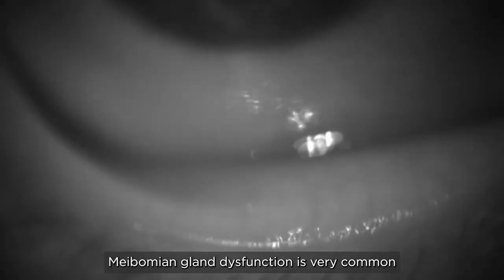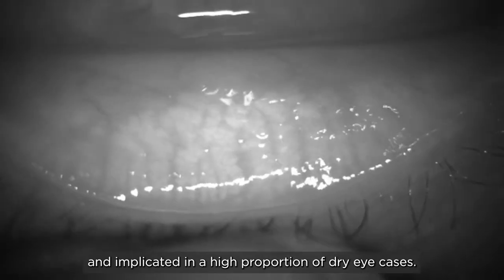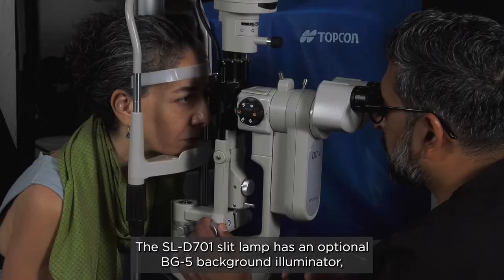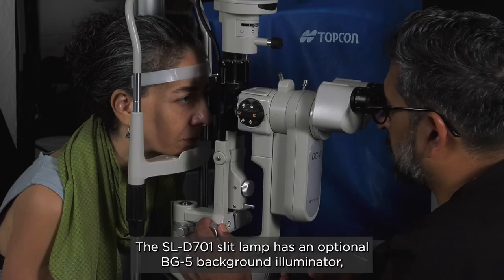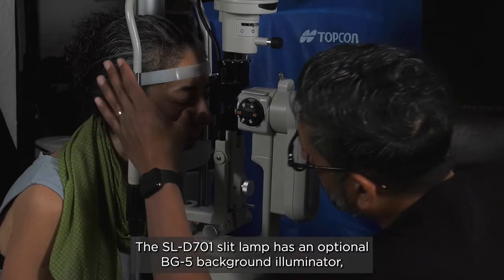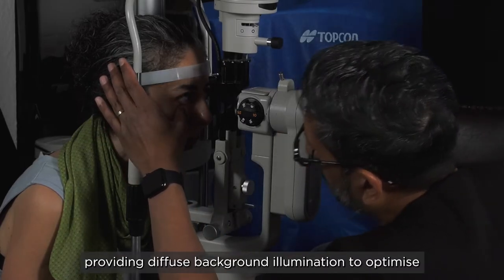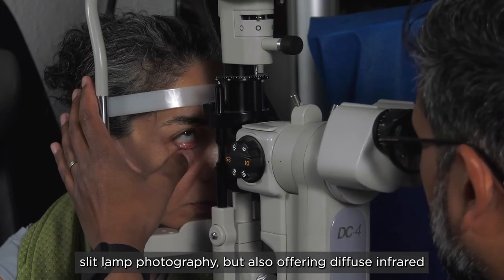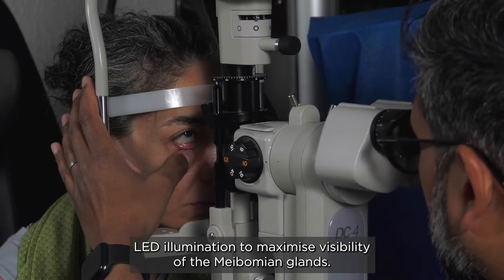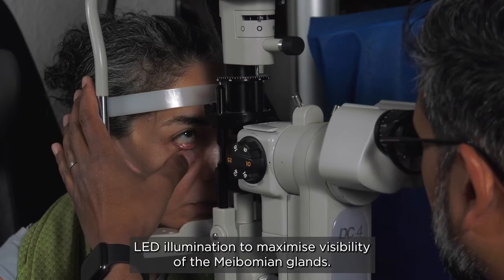Meibomian gland dysfunction is very common and implicated in a high proportion of dry eye cases. The SLD701 slit lamp has an optional BG5 background illuminator providing diffuse background illumination to optimize slit lamp photography, but also offering diffuse infrared LED illumination to maximize visibility of the meibomian glands.